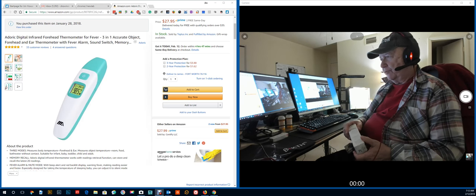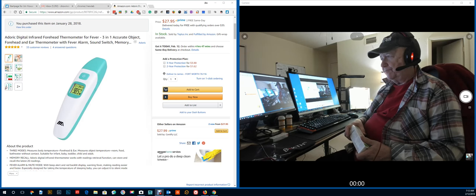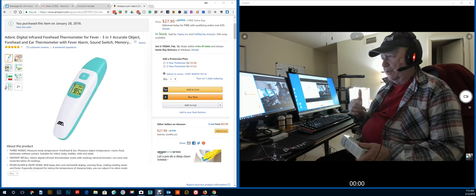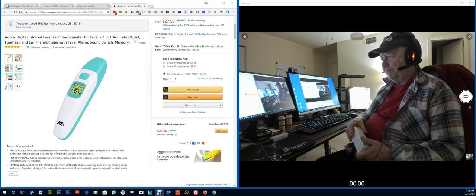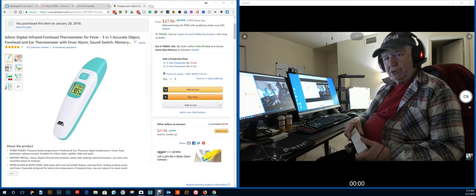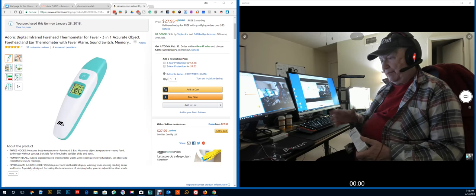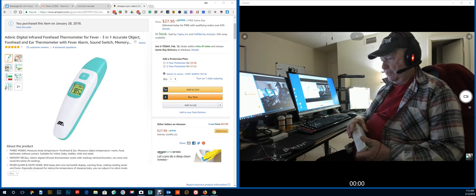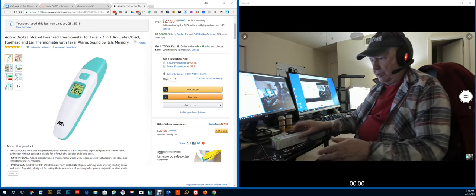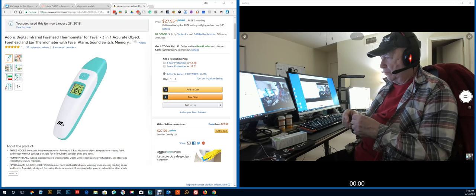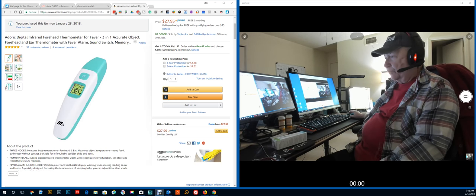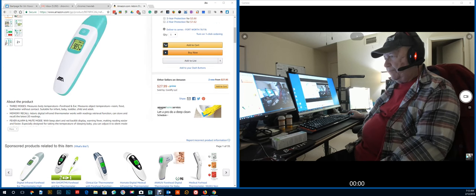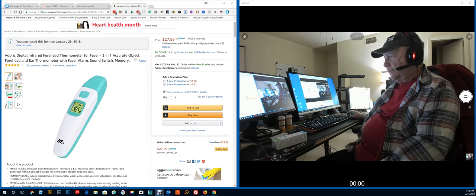On Amazon here it says forehead thermometer for fever. It's actually for forehead and an ear thermometer. Also, it takes a temperature of inanimate objects. So you could take the temperature of some device or I think they use as an example a baby bottle.